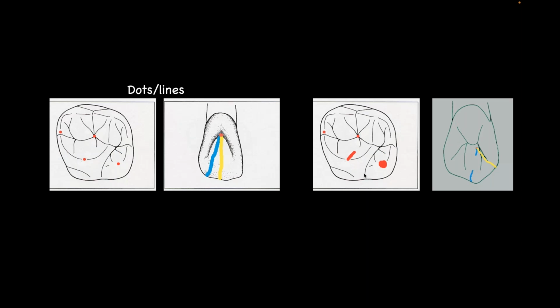So I have to think that through in my cast because remember, I just told you, especially the upper teeth, they're on ligaments. They have more movement to them. Your model does not. So when you're closing your articulator and pulling your shim stock through and you're getting a mark, it's not as accurate as what you're getting in the mouth, because the mouth is going to have more pressure in those areas.